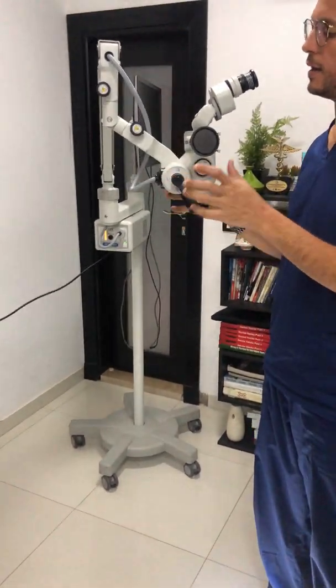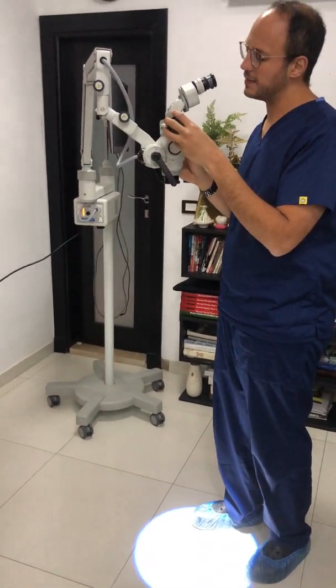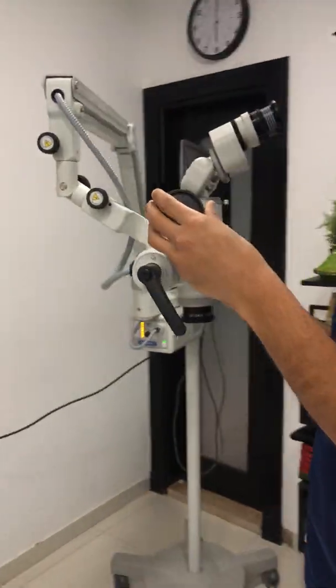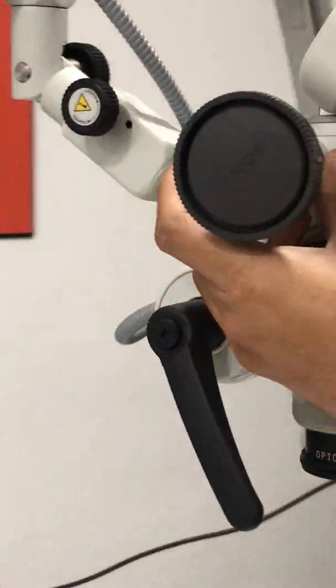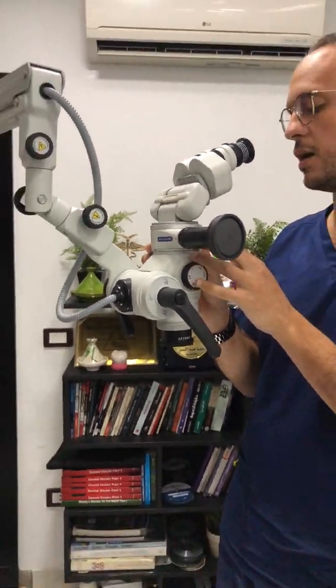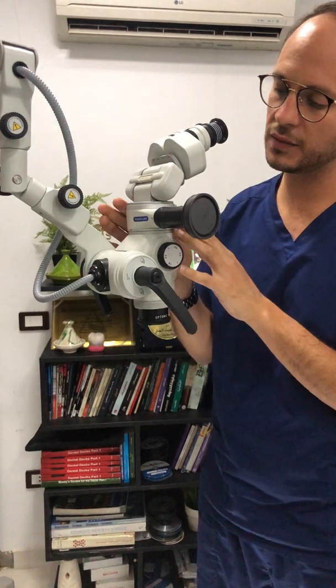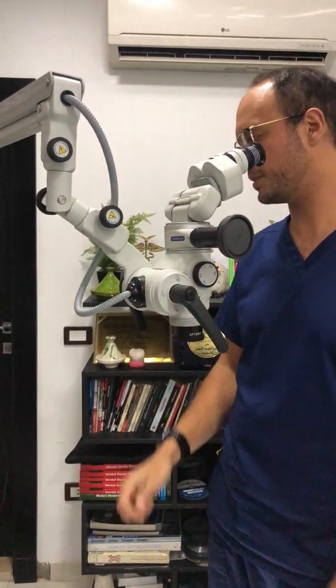One last point: the microscope came with a connection for a Sony Alpha camera, but when connecting the camera, the image quality that came out wasn't good. I think something is not optimal at the level of the beam splitter or the adapter of the microscope itself.